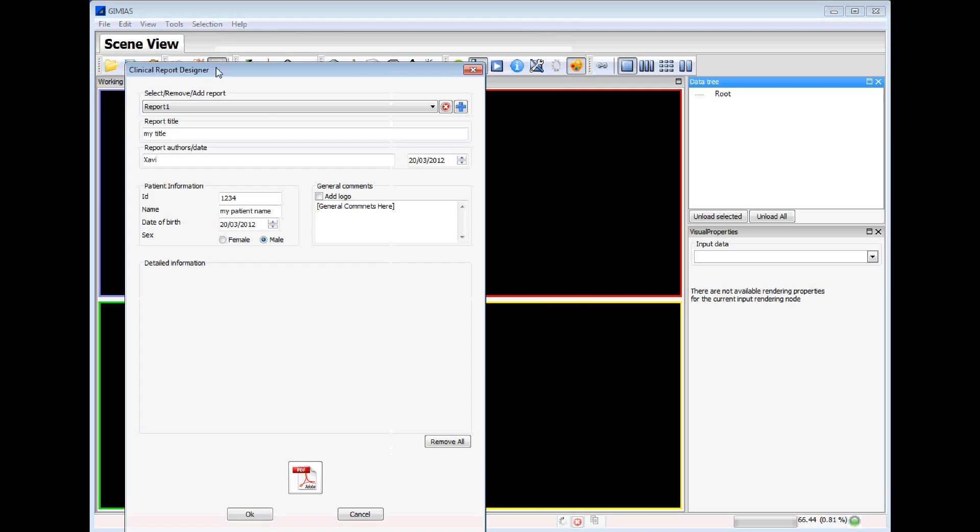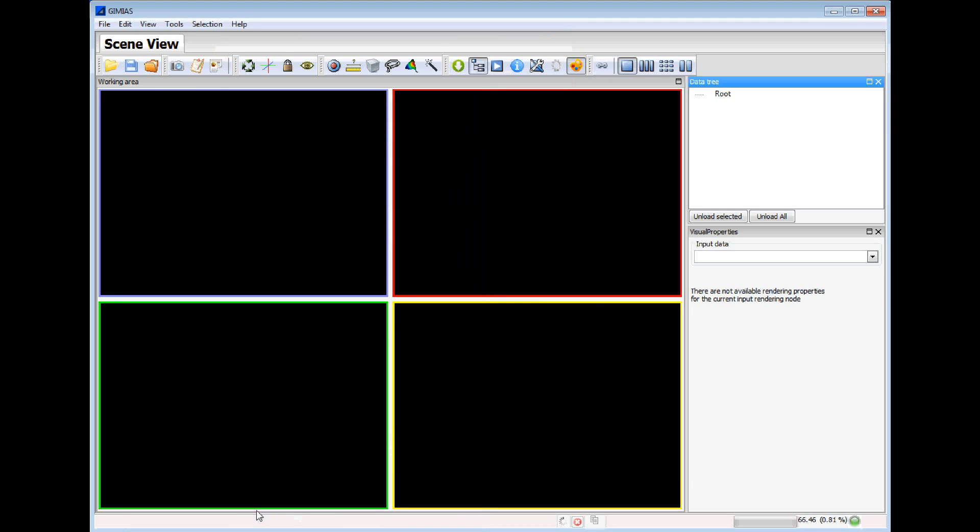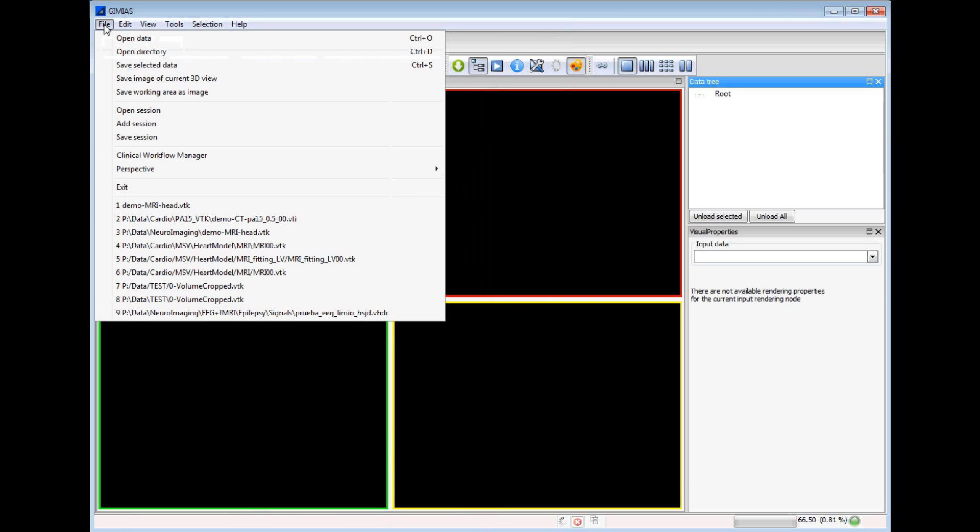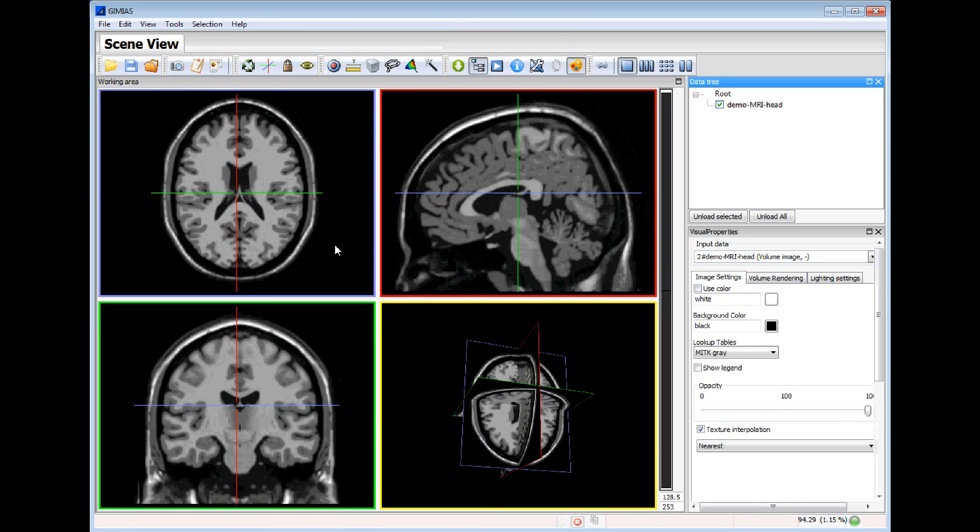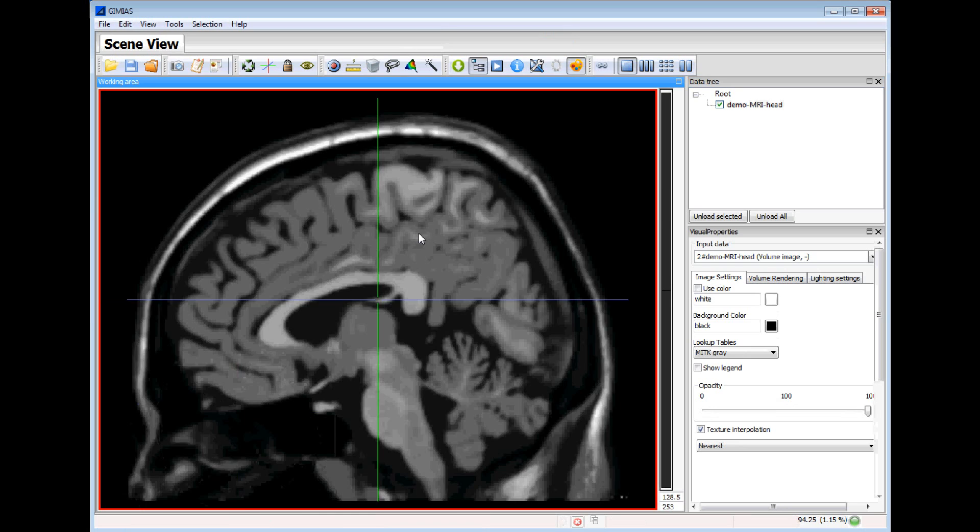Now we created the first report and we will start the processing of the image. We will open an MRI image of the head of the patient. You can see the image.